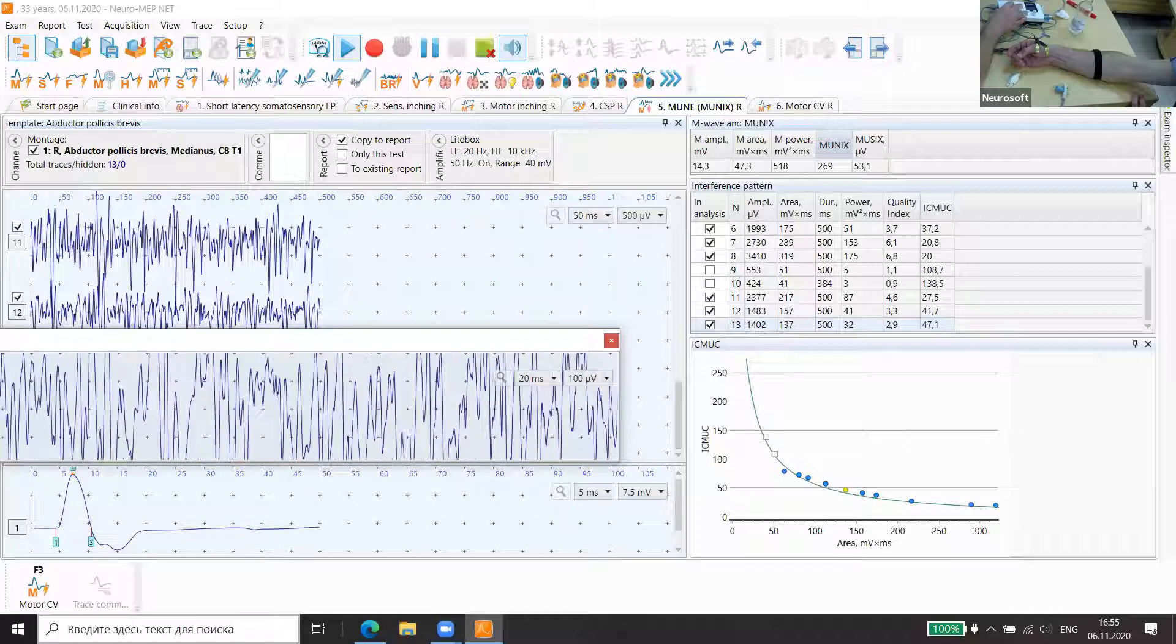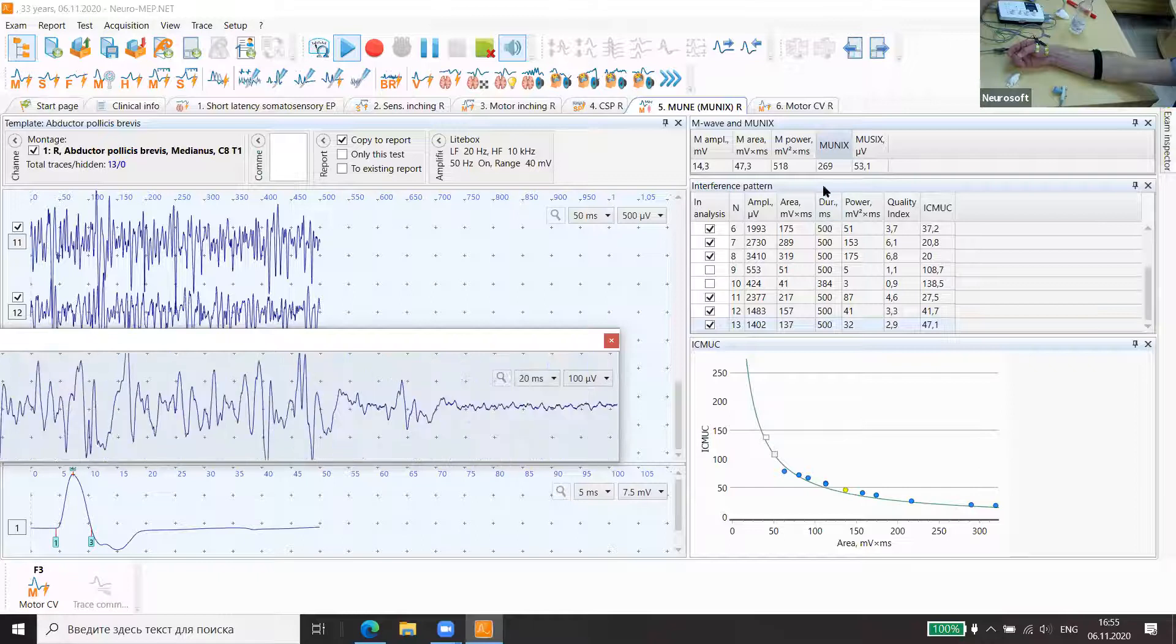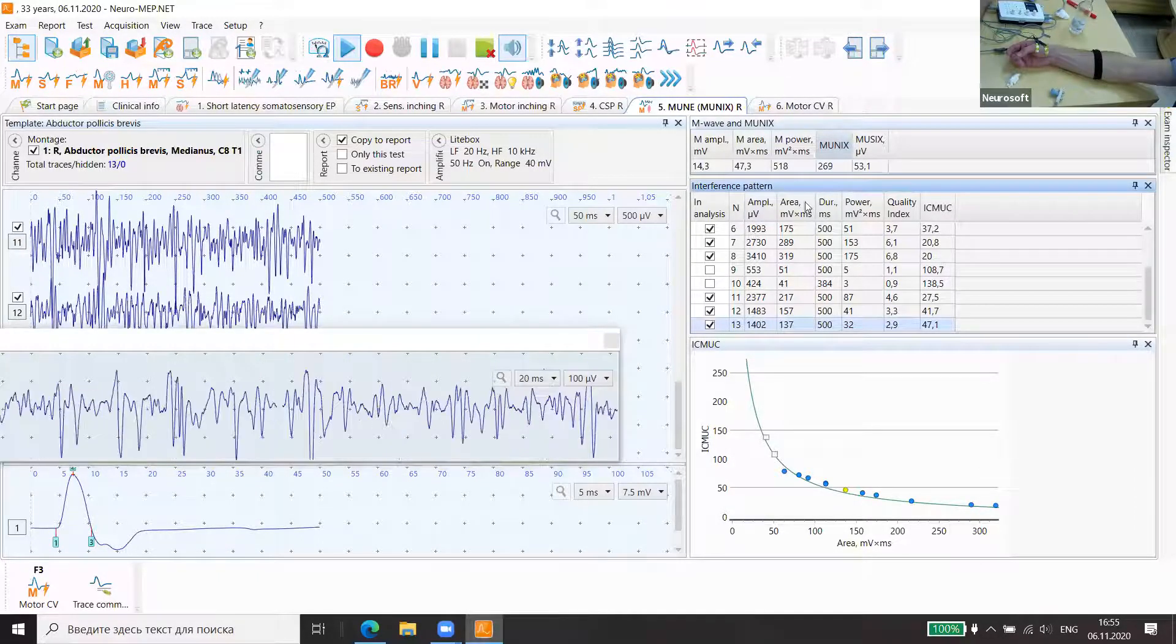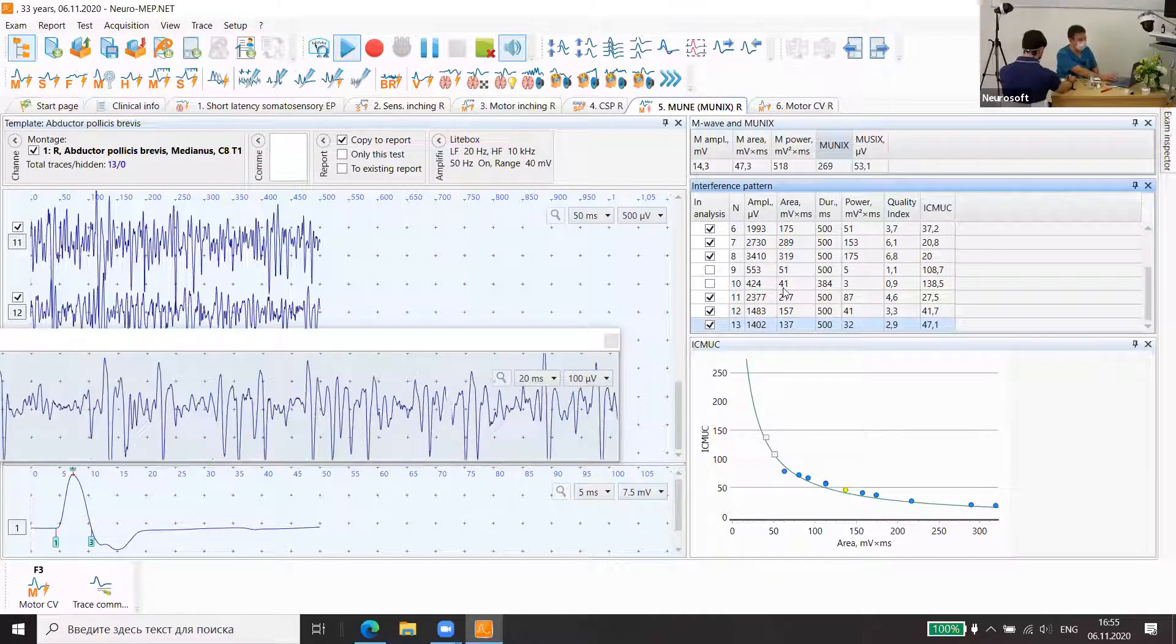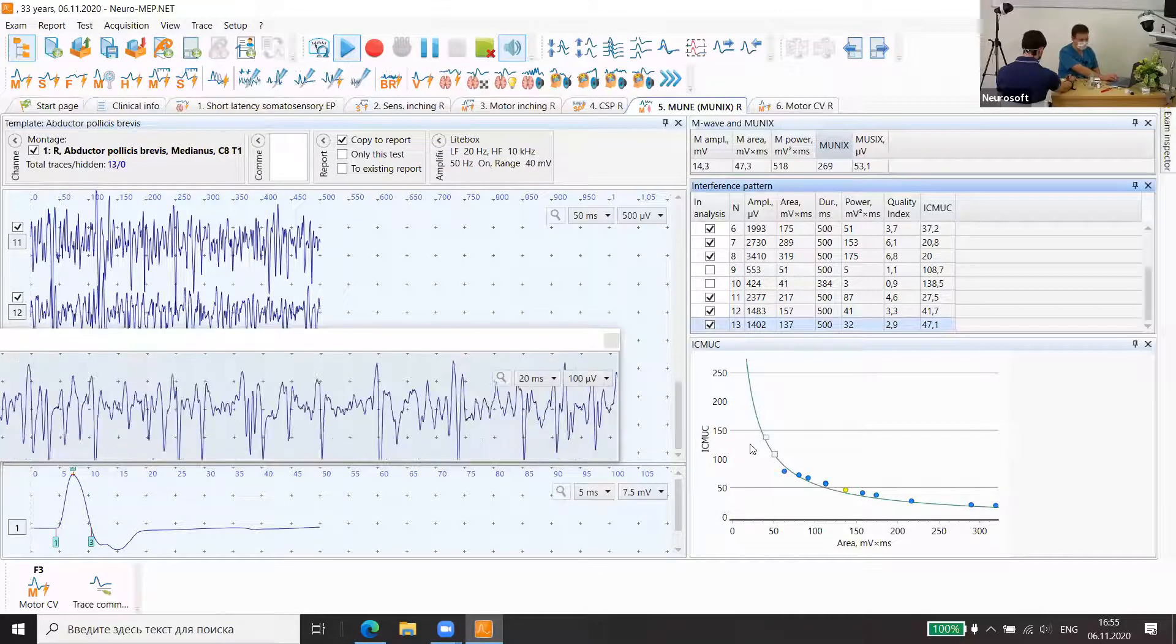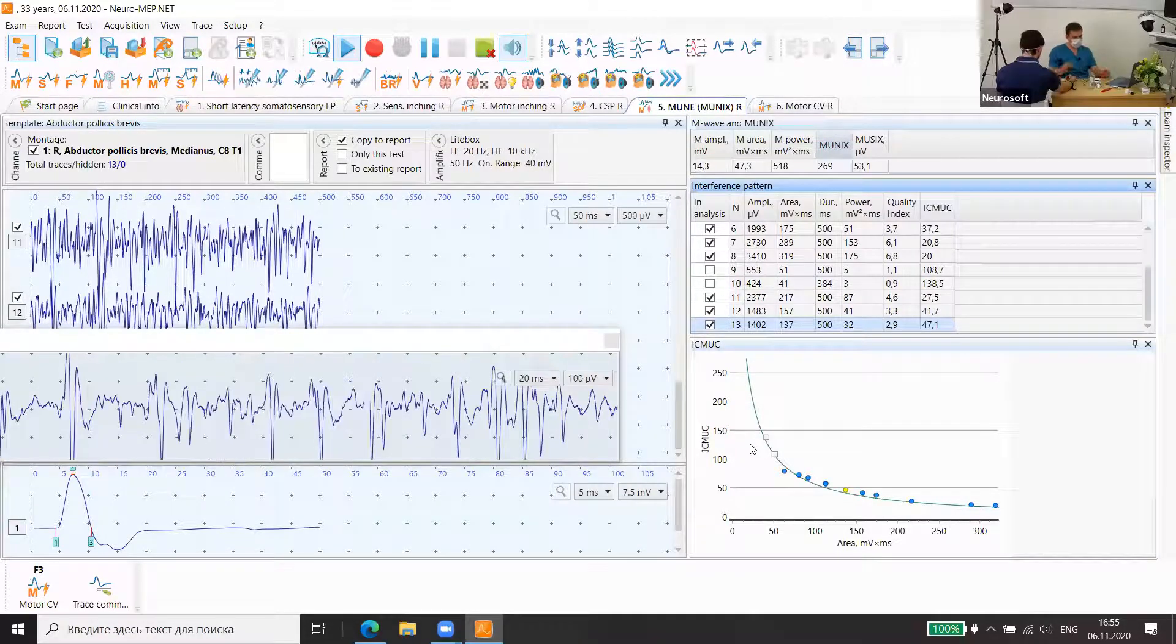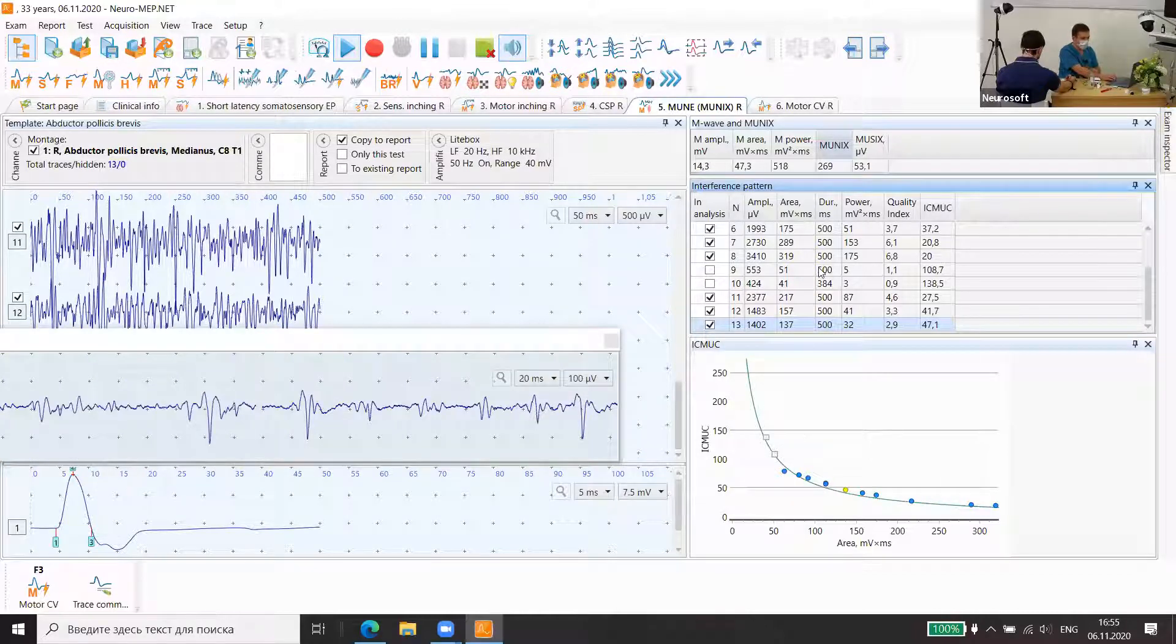Already we can see the curve quite good. This is MUNIX. There are different data about MUNIX normal values, but it's semi-scientific methods nowadays. We can go up to 20 measurements.